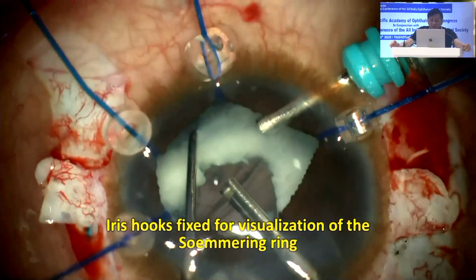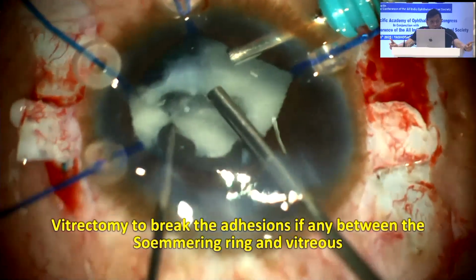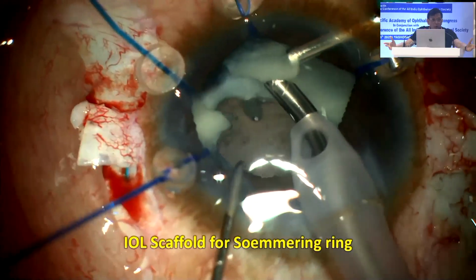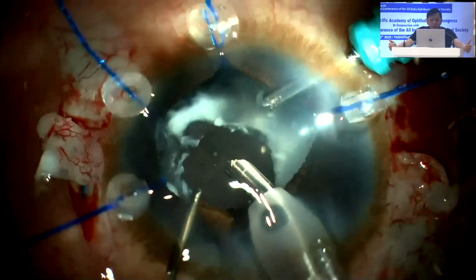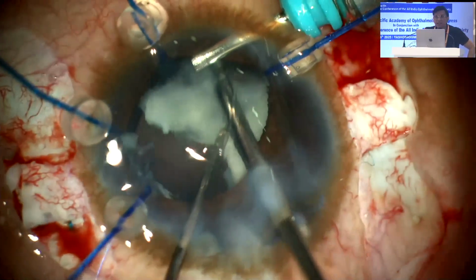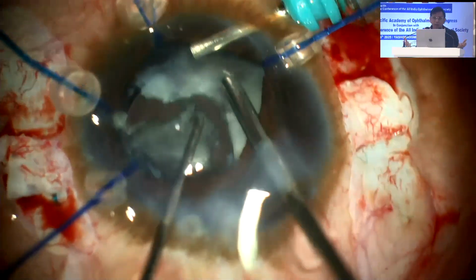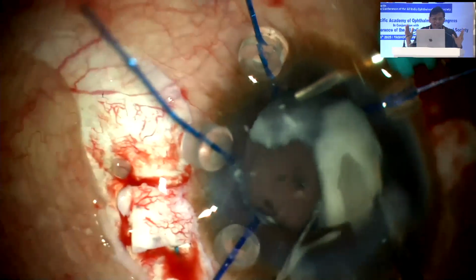So what I do is dilate it with iris hooks. Break the adhesions like I showed you in the animation. Bring it to the center. This Soemmering ring now cannot fall down. The IOL is there. That means you have created your own posterior capsule. Once you have done that, now you can very nicely emulsify it. You can burp it out, or use a cartridge to suck it out. Any technique you can do.